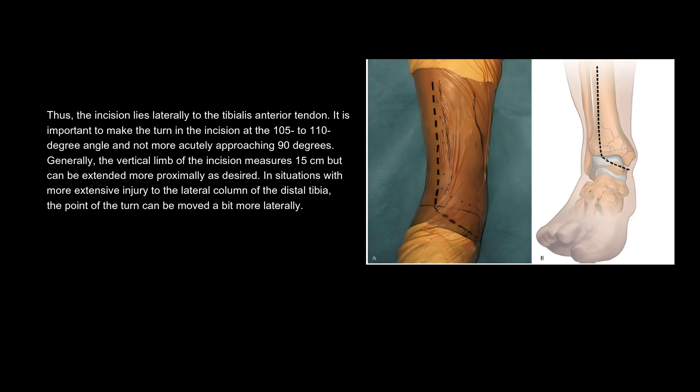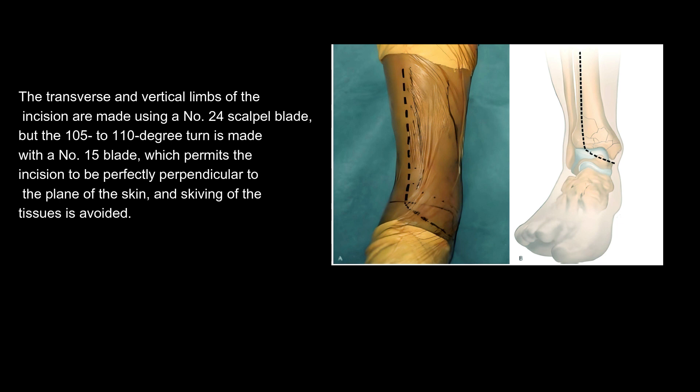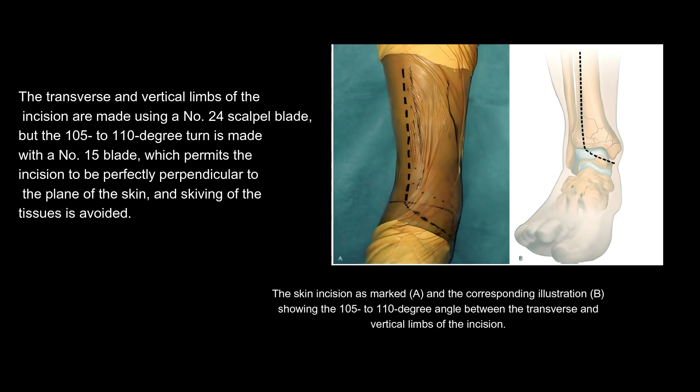Generally, the vertical limb of the incision measures 15 cm but can be extended more proximally as desired. In situations with more extensive injury to the lateral column of the distal tibia, the point of the turn can be moved a bit more laterally. The transverse and vertical limbs of the incision are made using a number 24 scalpel blade, but the 105 to 110 degree turn is made with a number 15 blade, which permits the incision to be perfectly perpendicular to the plane of the skin and skiving of the tissues is avoided.